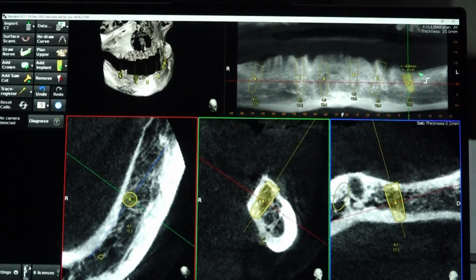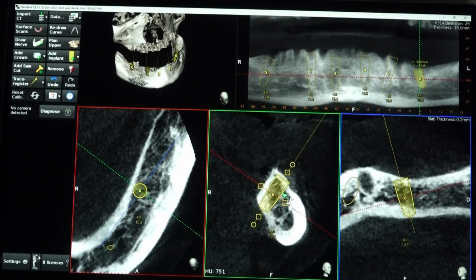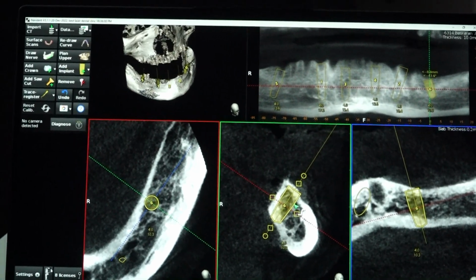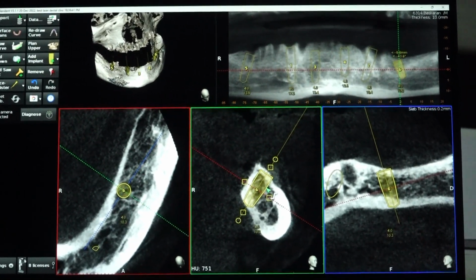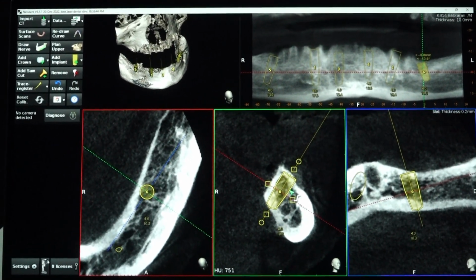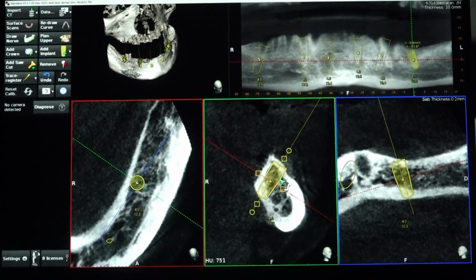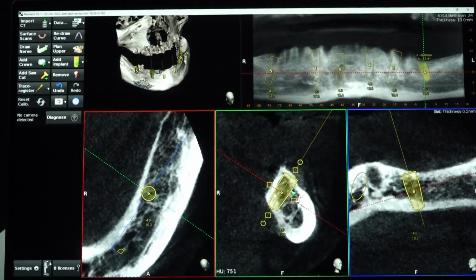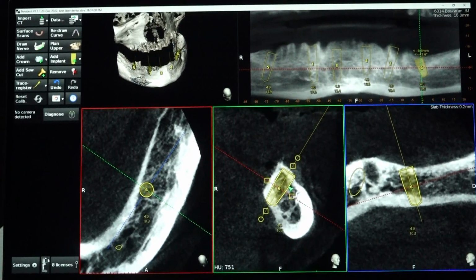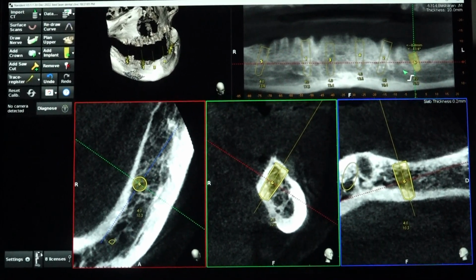So better we open the flap here and reflect the nerve away from the channel. It is just creating a depression over the surface and that is good. If you reflect the periosteum, along with the periosteum the nerve will go away. You don't have to worry about anything. Okay, it is not deep in the bone, it is just adapted close to the bone, that's it. If you do a flap reflection under the periosteum, nothing is injured. Okay, so with subperiosteal reflection of the flap, you won't injure the nerve.